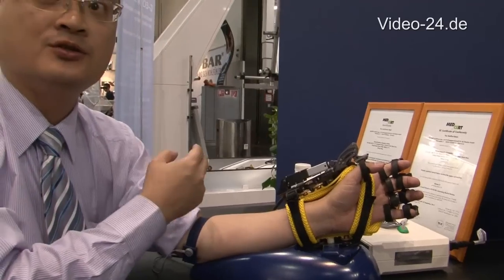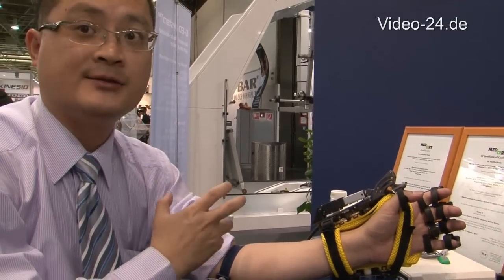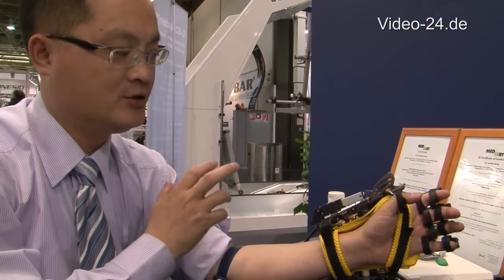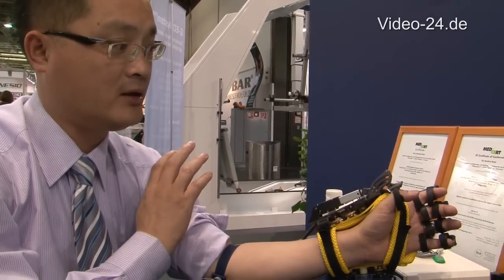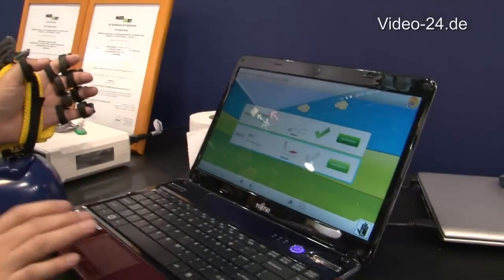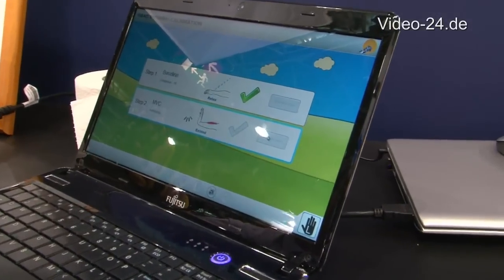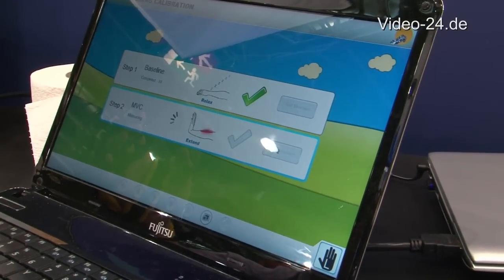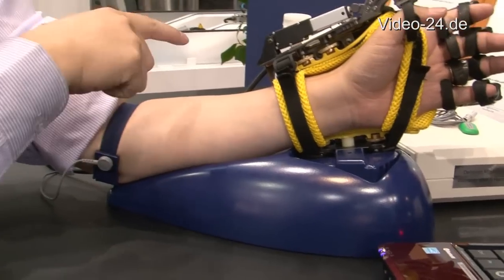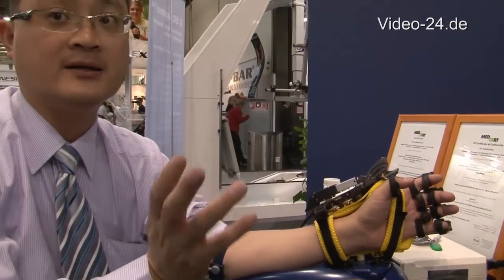Patients have the intention to move or extend the hand, but they are too weak to control the extension. So I pretend to be a stroke patient. I just have an intention to do the action. This is my EMG from the intention, not the real extension. The real extension may be much bigger than this figure.